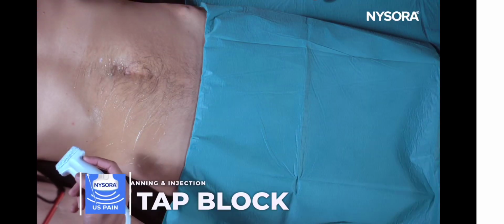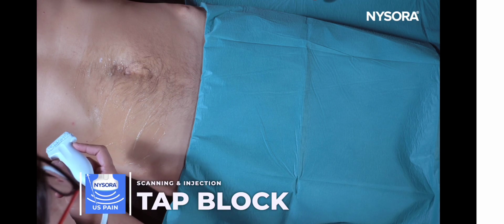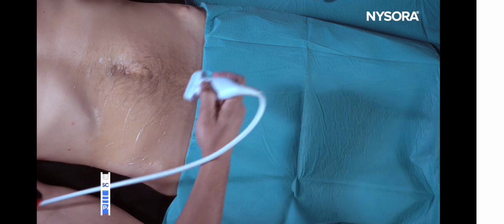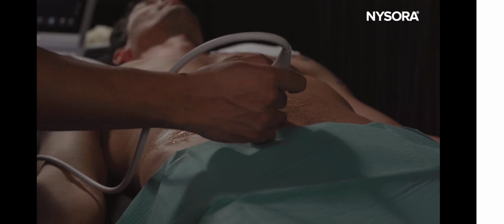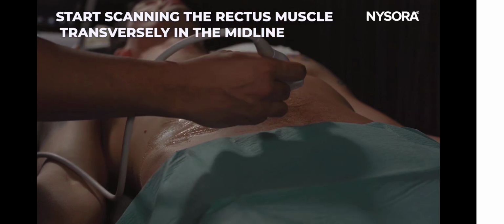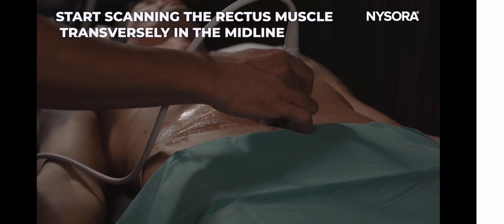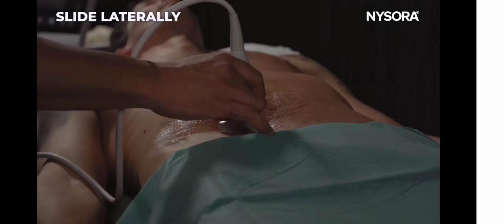So I'm going to talk about the classic TAP plane block, a transverse abdominis plane block, for lower abdominal post-surgical pain or chronic post-surgical pain, post-cesarean section pain.